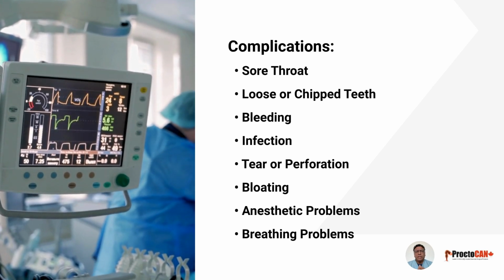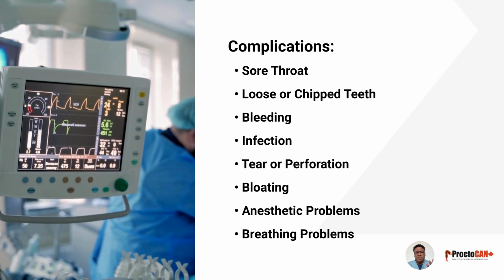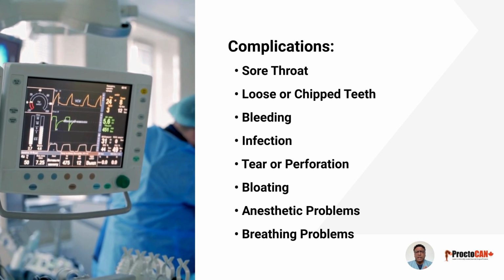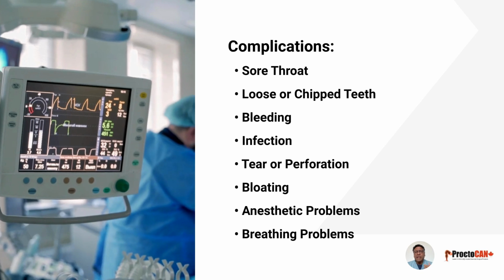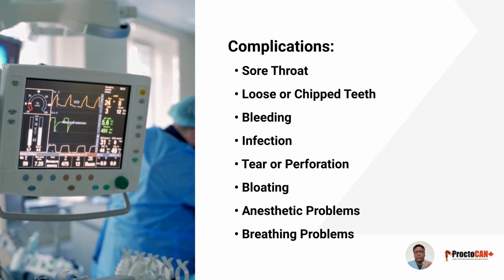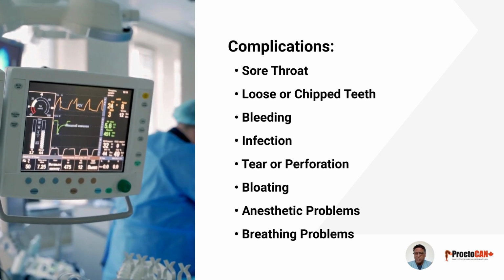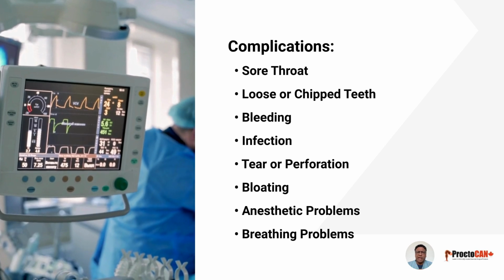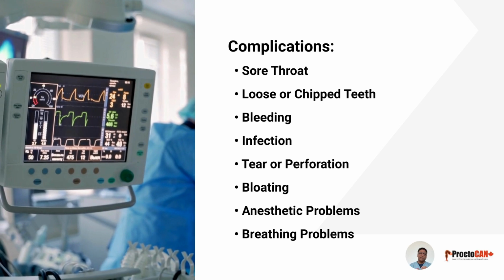It's also important to mention that, as with other endoscopic procedures, air is gently introduced into your digestive tract during a gastroscopy to help improve visibility. This may cause temporary bloating, gas, or mild discomfort after the procedure, which should resolve on its own within a few hours. Although rare, there are potential risks associated with anesthesia or sedation, such as allergic reactions, difficulty breathing, or heart issues.